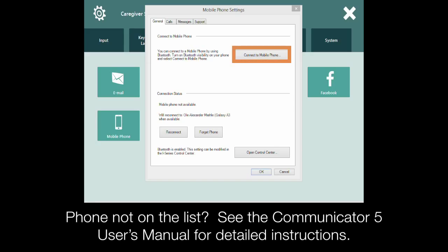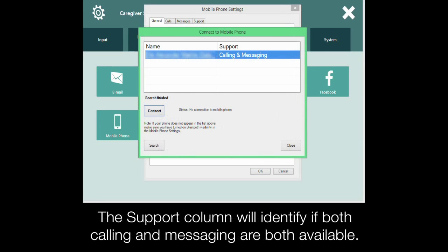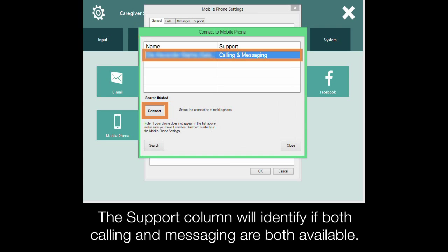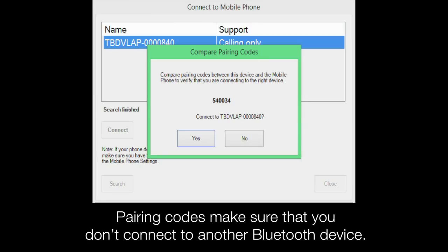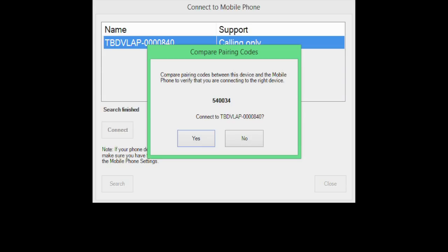Select the Connect to Mobile Phone button. Communicator will search for any Bluetooth devices within range. Select your phone from the list and then select the Connect button. Make sure the pairing codes are the same on both your device screen and your phone. This is to make sure that you don't connect to another Bluetooth device. Confirm on both your phone and device.